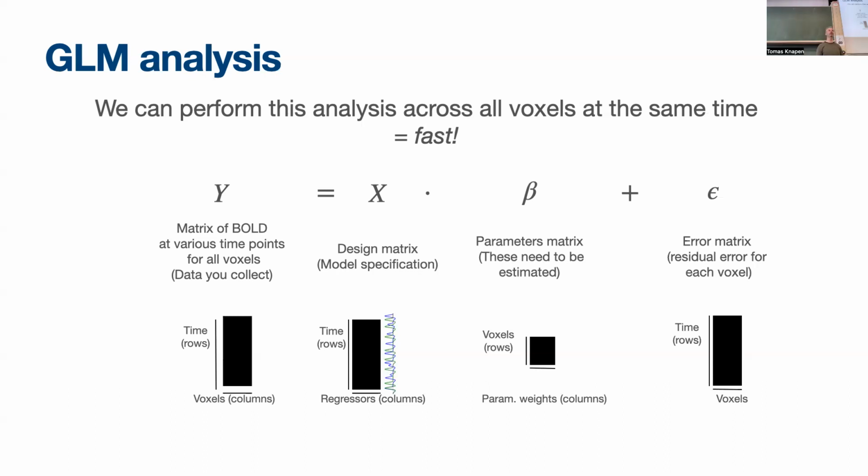Yeah? So we have a time course for every voxel in the brain of stuff that we hate, right? The stuff that we couldn't explain. It's so frustrating. You see it? This is all the stuff that you have no handle on. It's when your subject was coughing in the scanner and you didn't hear because the machine is so loud, right? Signals going up and down throughout the brain and you didn't know.